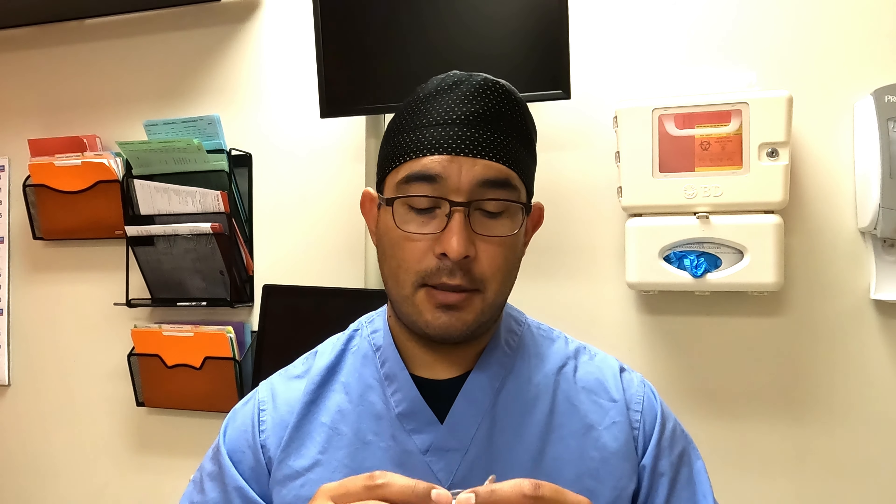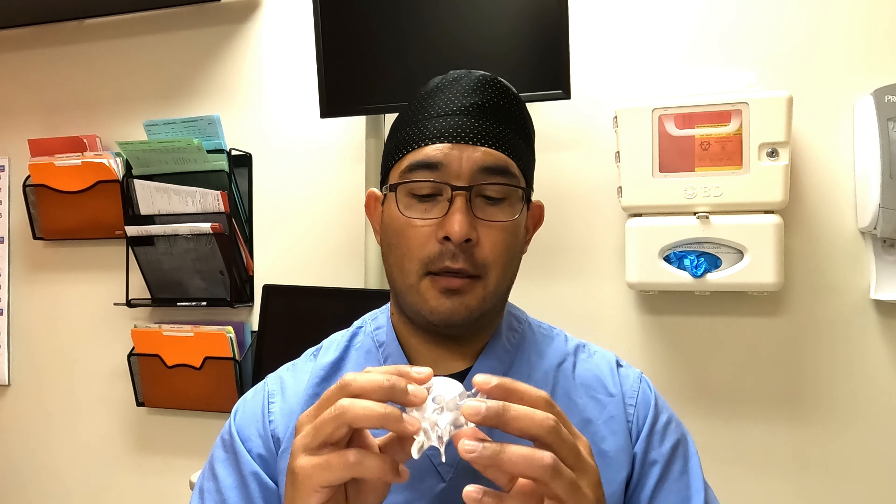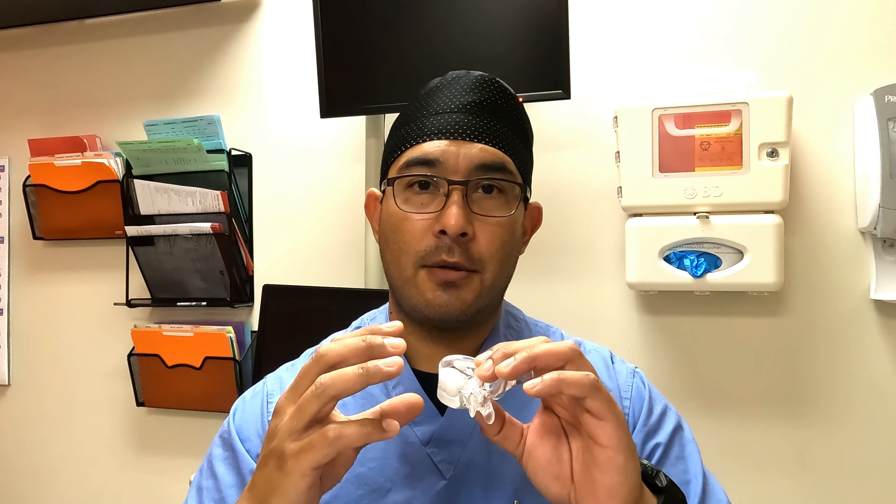A lot of times to get these patients out of pain we can perform a procedure called a kyphoplasty. Kyphoplasty takes approximately 30 minutes. We perform two small incisions through the back of the vertebral body, and then we inflate the vertebral body back to its original height, and then we place cement within the vertebral body. This is primarily a procedure that is performed to alleviate pain and to get these patients up and more mobile.